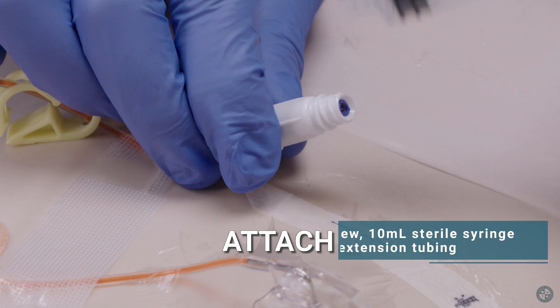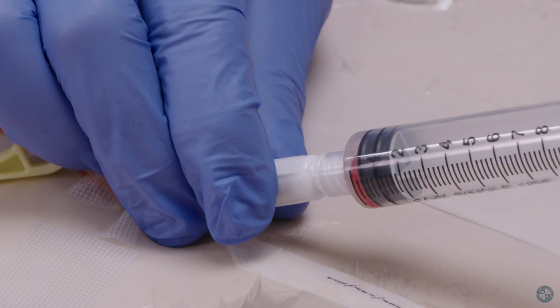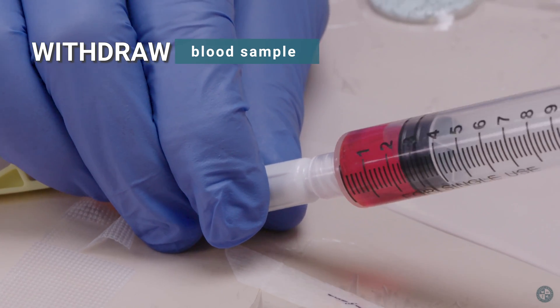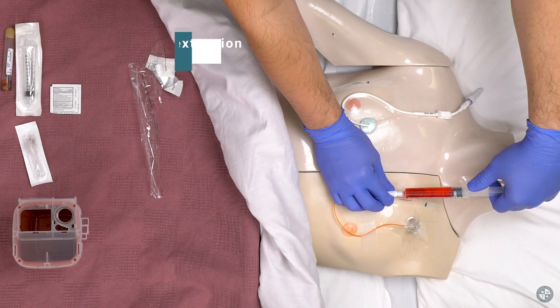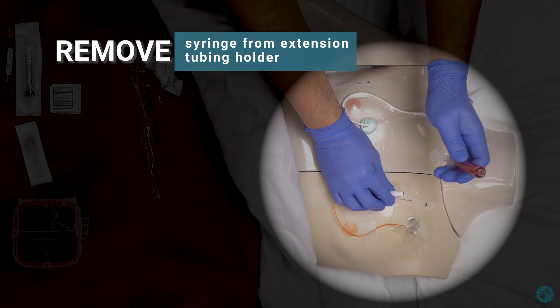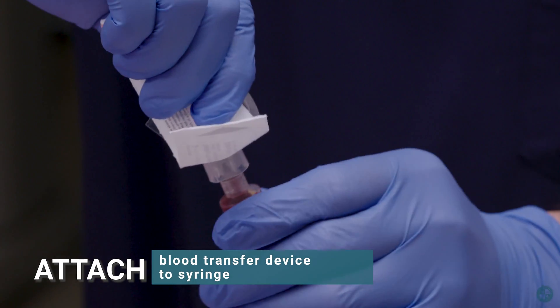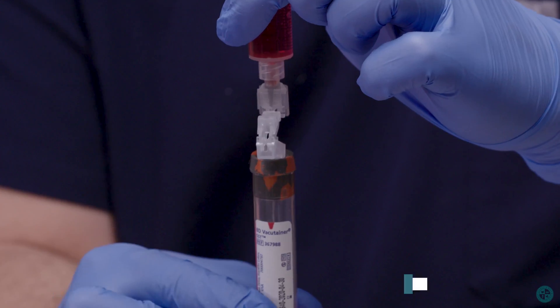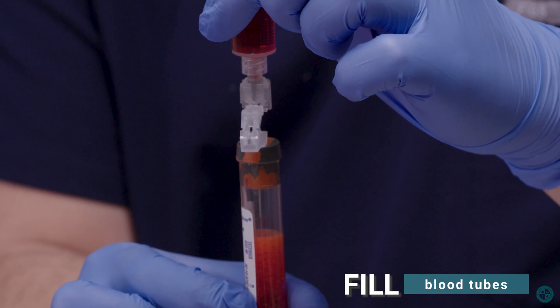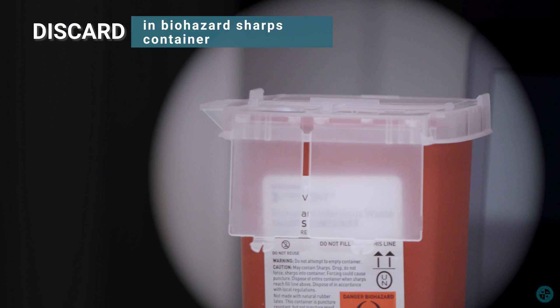Attach a new 10 milliliter sterile syringe to extension tubing and withdraw the blood sample. Remove the syringe from the extension tubing holder. Attach a blood transfer device to the syringe and fill blood tubes, then discard in the biohazard sharps container.